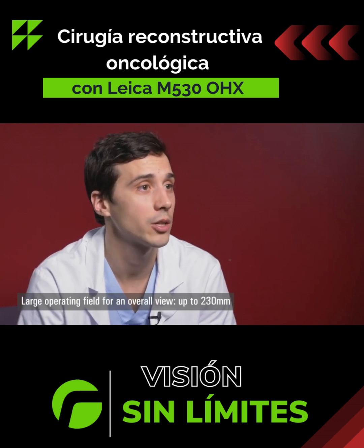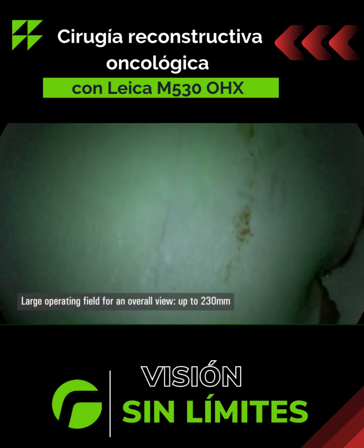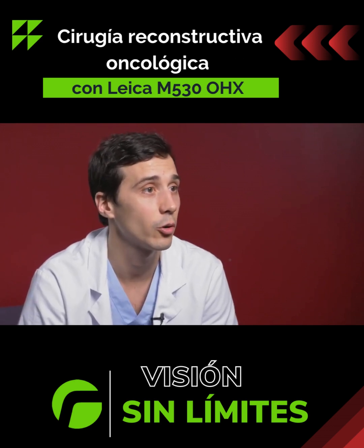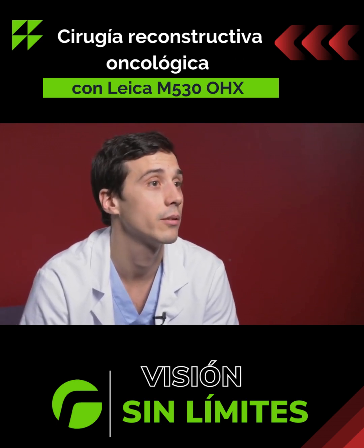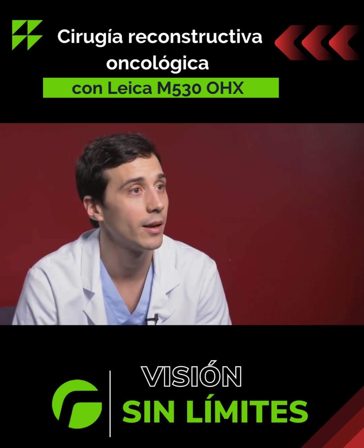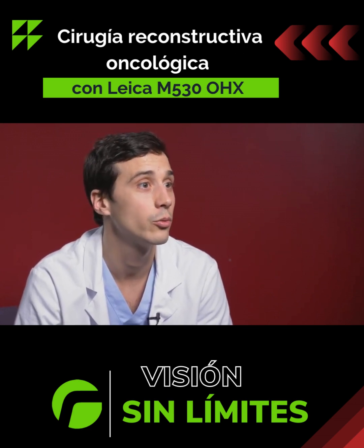You can see much better; you have a much wider field with the O-HX microscope, which allows you to have an overall view. This is very important since with a conventional microscope you have to move the camera, which can be very awkward when you have a flap that is quite large.